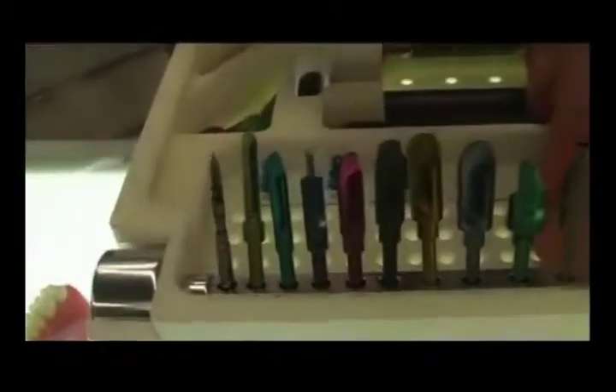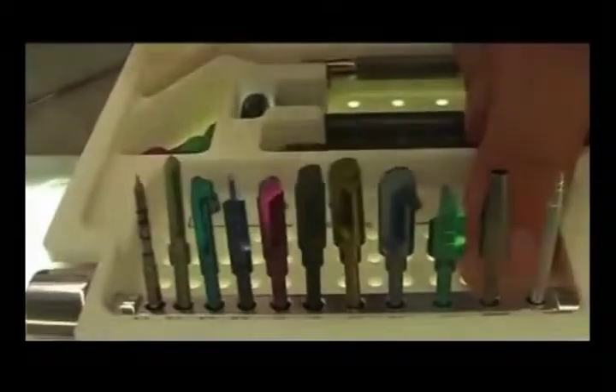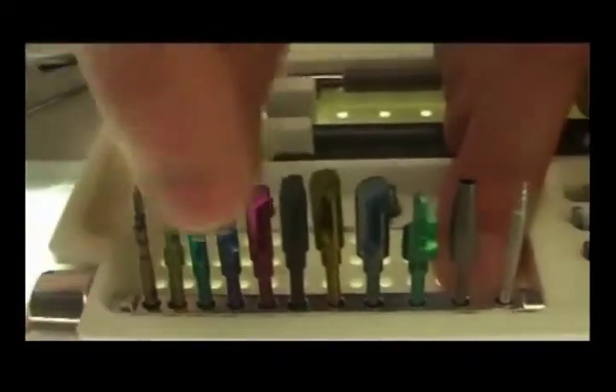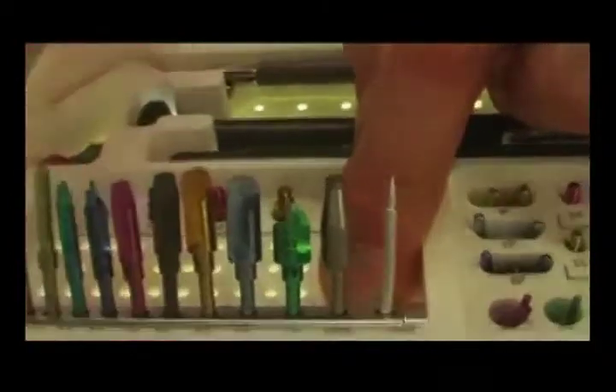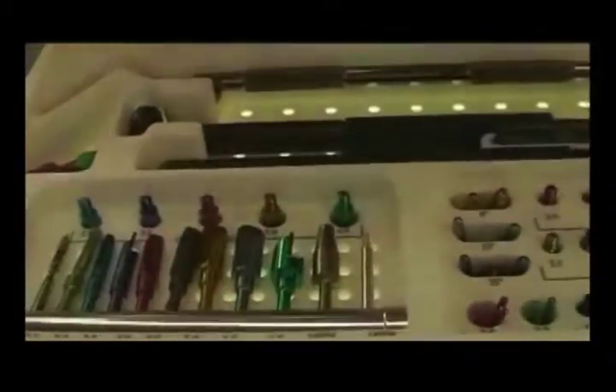When you start with the latch reamers, the drilling is at a very low speed of 50 RPMs without irrigation. And as you're drilling, you're collecting the bone from the flutes of the reamer, and you're saving that bone to pack on top of the implant.